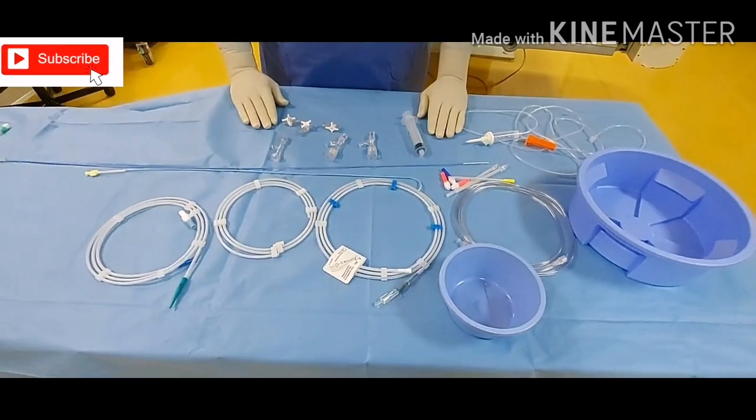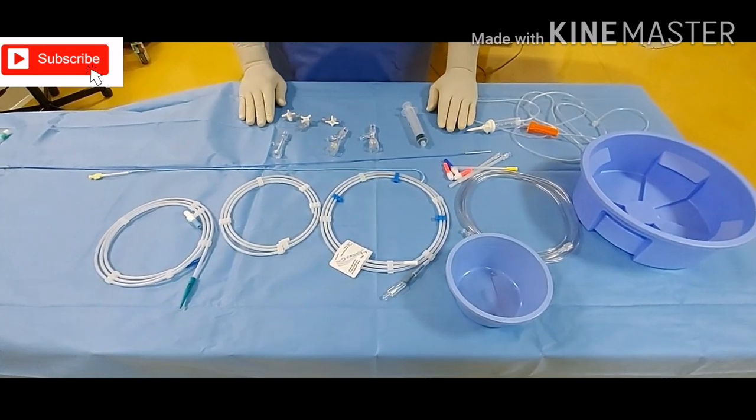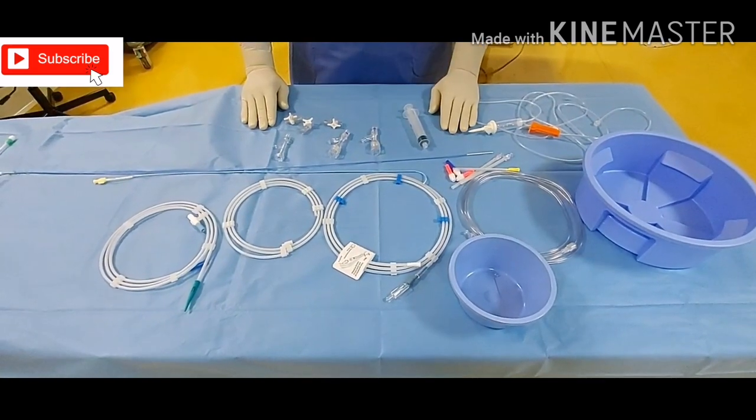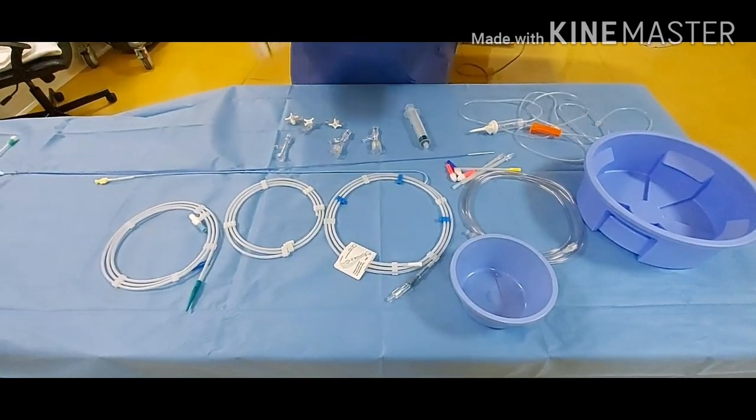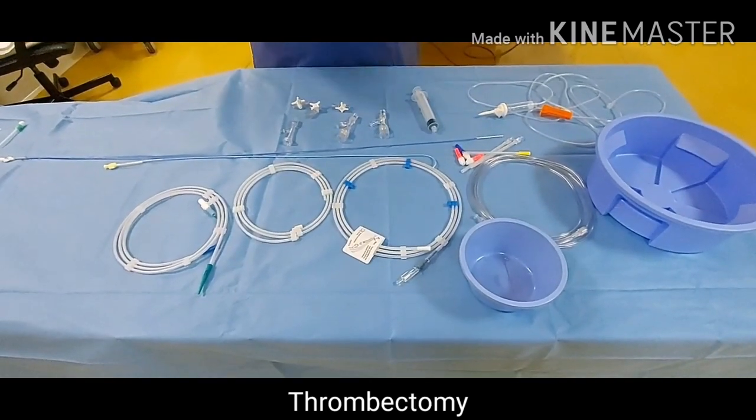Assalamu alaikum, this is Imran, interventional radiology nurse. Today we are going to demonstrate how to prepare the items for cerebrovascular accident — it is called mechanical thrombectomy also. We should be very quick and prepare as early as possible.